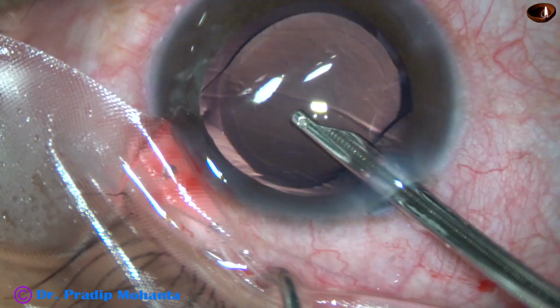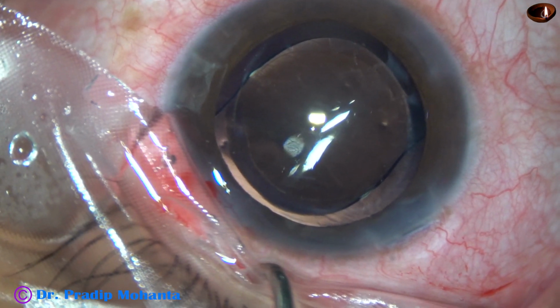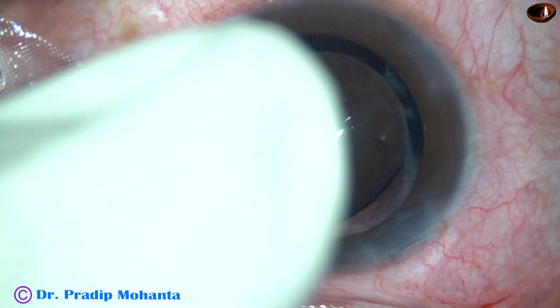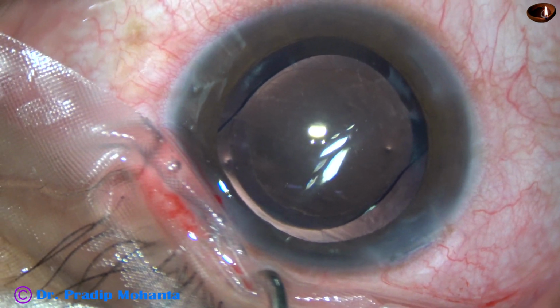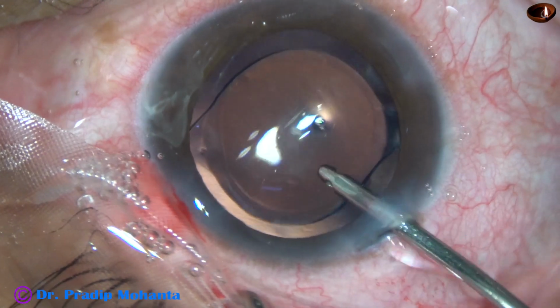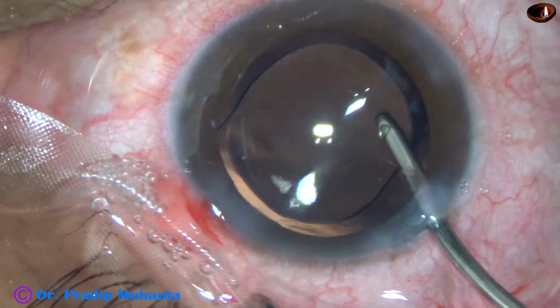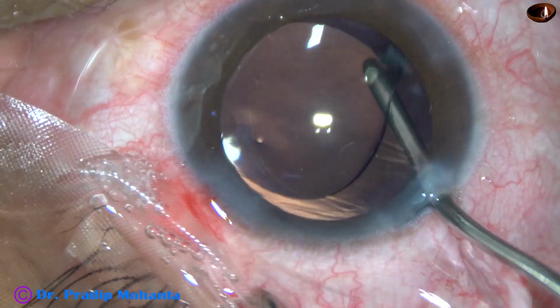If there is retained visco, it can cause raised intraocular pressure in the postoperative period, and we have to treat that medically. The patient will be unhappy. So better to give some quality time at this moment and avoid the post-op rise of intraocular pressure.